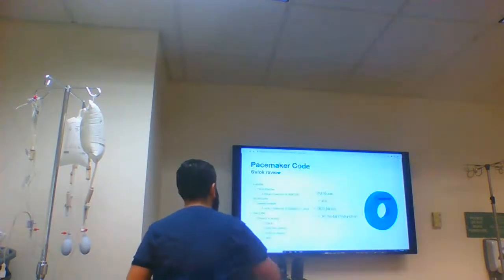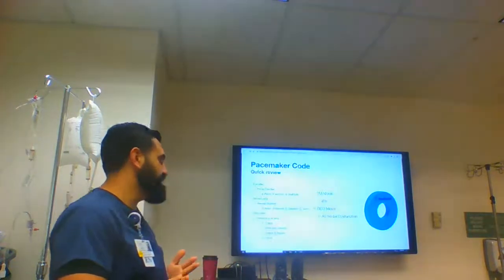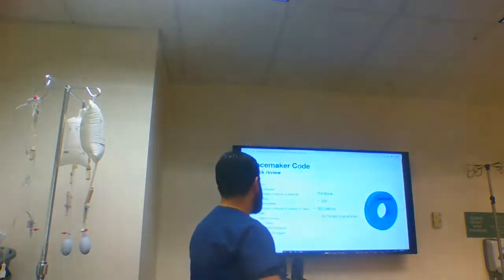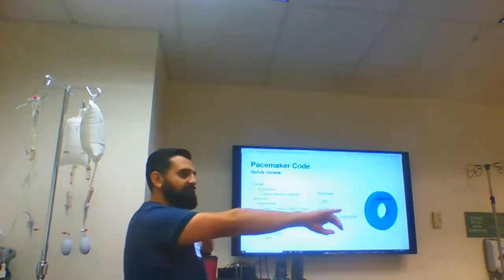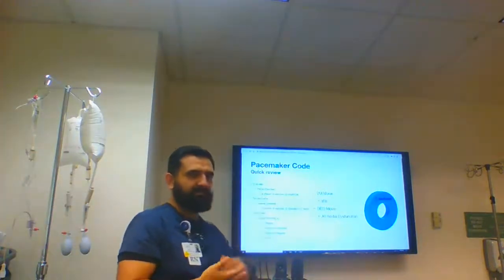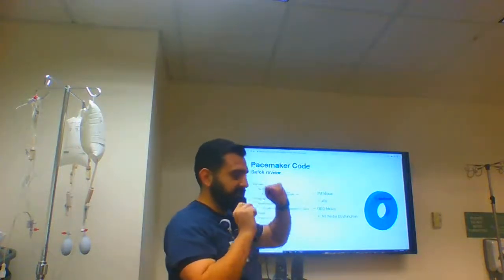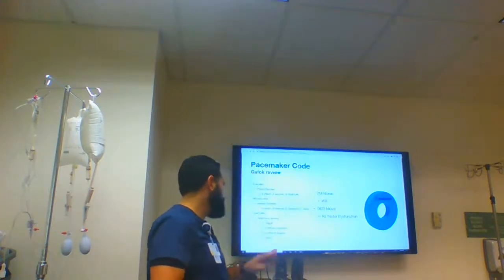Okay. Speaking of cardiac pacing, real quick, we'll go over the pacemaker code and what each letter is. By the way, they'll go up to five letters now, but at the bedside setting as emergent pacers, you'll typically go up to three letters, right? Sometimes if you have a patient with an actual pacer and you have all the info, those are really sophisticated. They're titrated to that patient, so they'll typically have five letters. But we're only going over the first three.